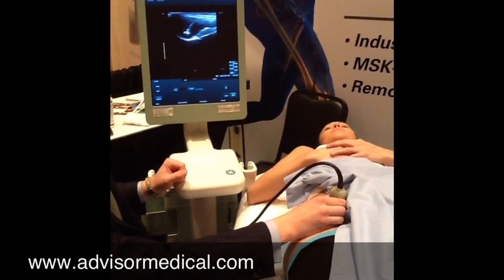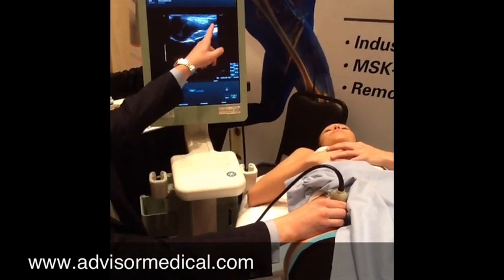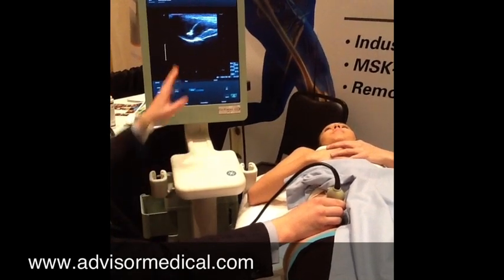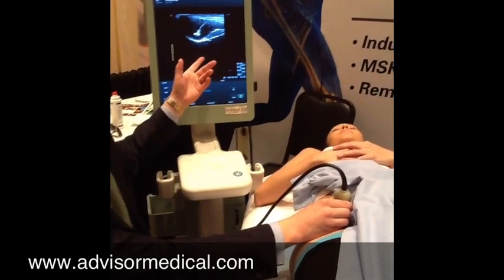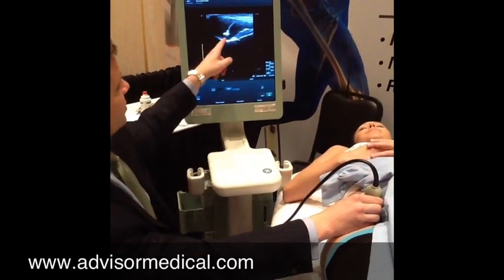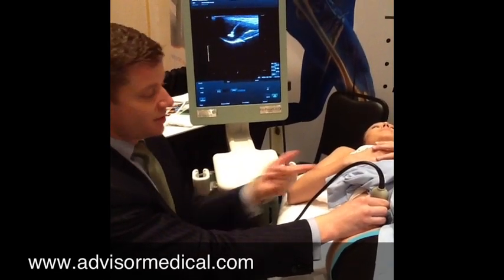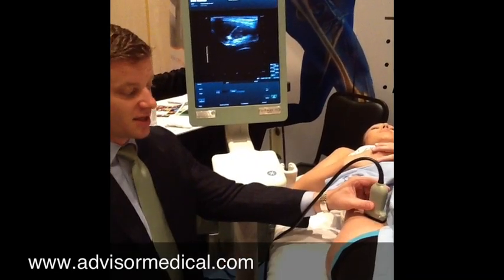If I go a little bit more medial I'm going to see the femoral artery pulsating here. So my starting point is here. This would also be the area where you would do your iliopsoas bursal injection with this view and with the transducer positioned like such.